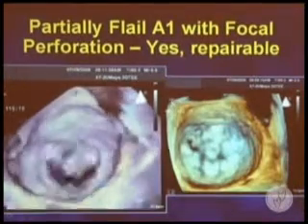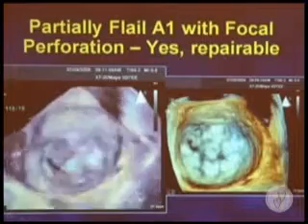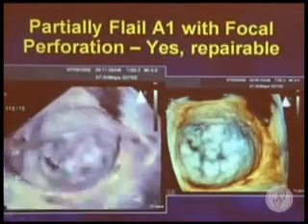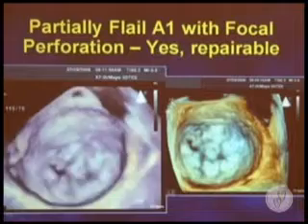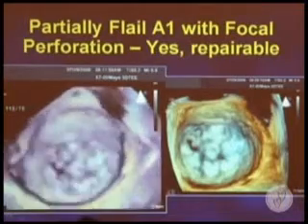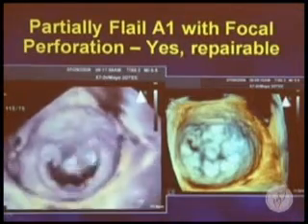We know that this is the anterior leaflet up here, and sure enough, we can see some damage here. This is a patient with previous endocarditis. It's flail. You might call it a slight perforation, especially on the still frame. It does involve a commissure, but the surgeon will know exactly what to address when he goes in there for the operation. And this valve is definitely repairable, easily repairable. When you show the surgeon this picture, he'll know exactly what to do when he gets in there. There won't be any surprises, and the patient can expect to have a good result even before they might be symptomatic.